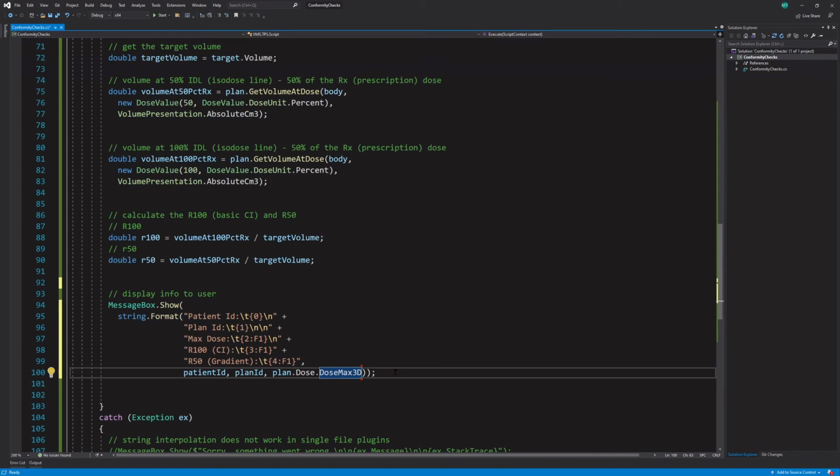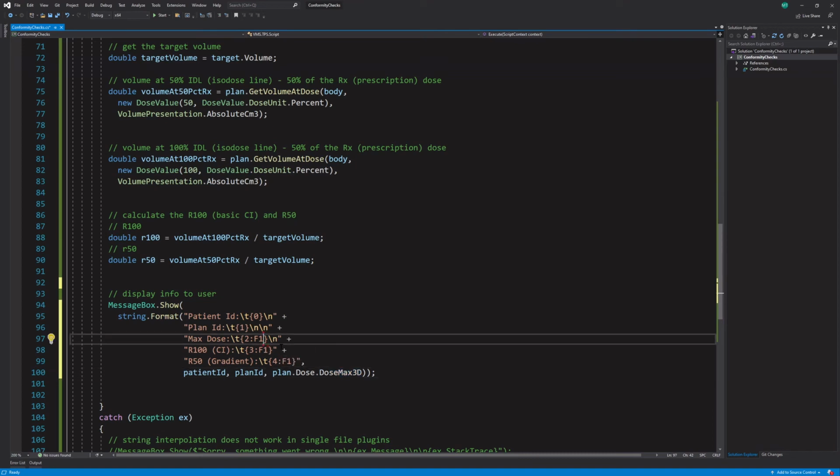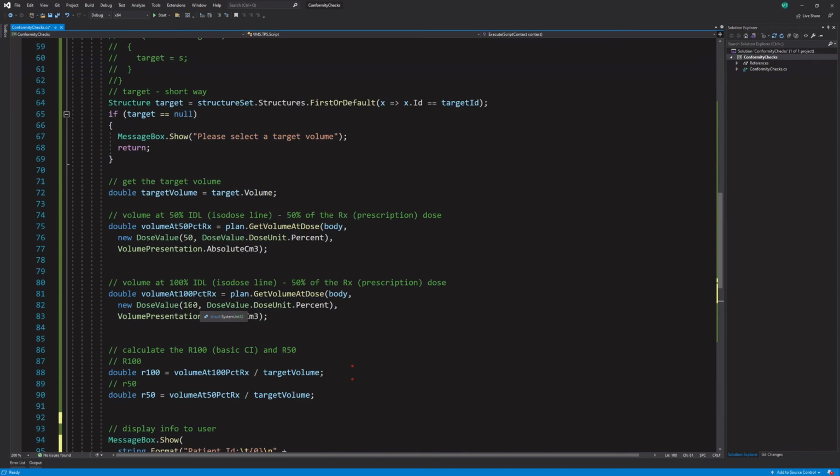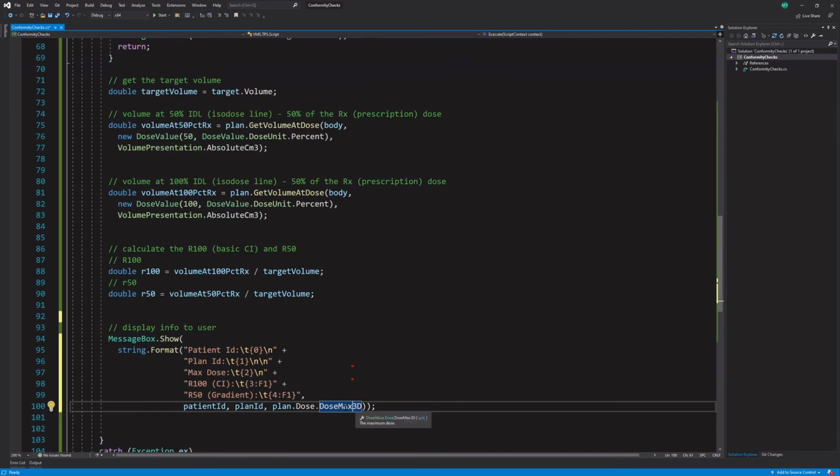It's a very useful thing, but okay, so dose max 3D, if we hover over it, we're actually going to get rid of this too, because it shouldn't be a bunch of decimals. It should just be like 1 or a few decimals. Okay, so this is a dose value, and what dose values are, if you remember up here, a dose value has a value and a unit. So if we just print this, being inside the string will automatically turn it to a string, but maybe you want to explicitly say ToString. This will give it both the dose value, the number, and the unit, which is kind of nice.